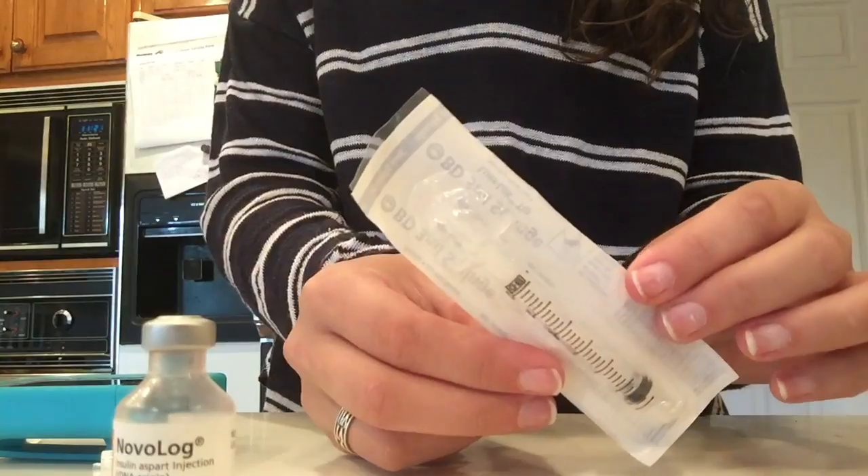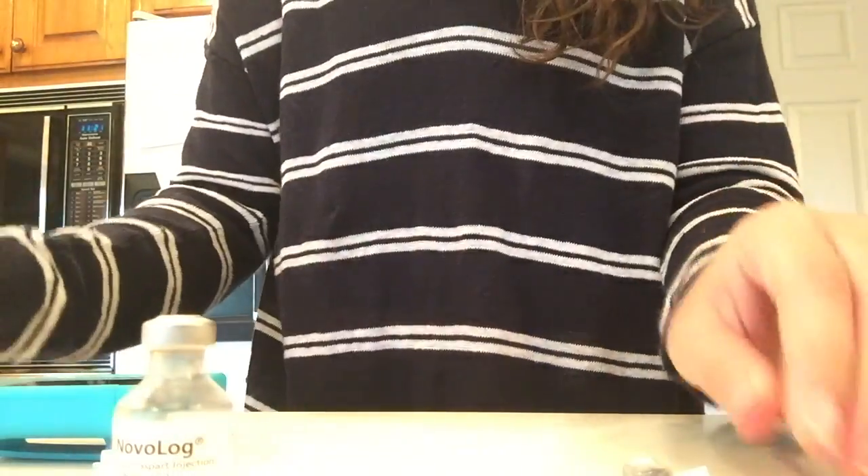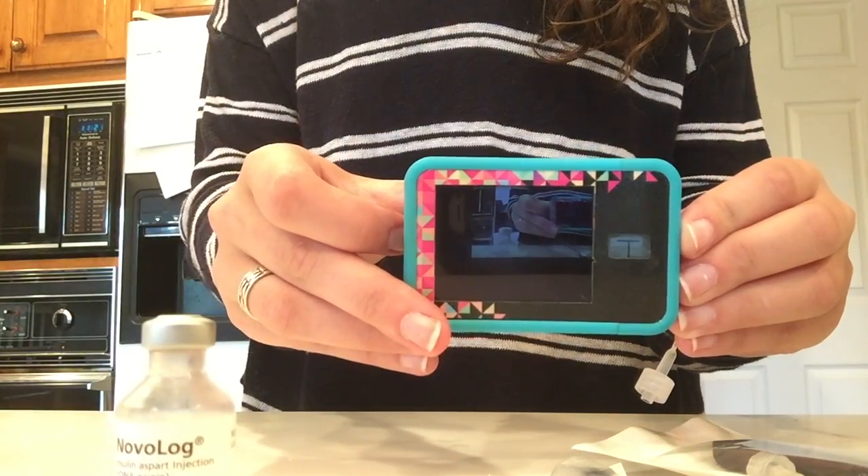With that being said, let's jump into the video and get started. The very first thing you're going to need is your insulin — I am on Novolog. Then you're going to need your syringe and your syringe needle, and then the cartridge itself, and then you need your pump, obviously.